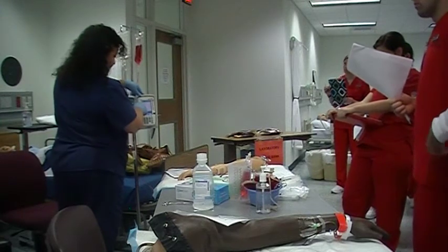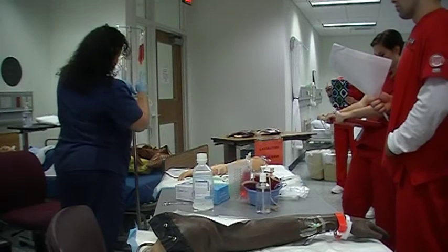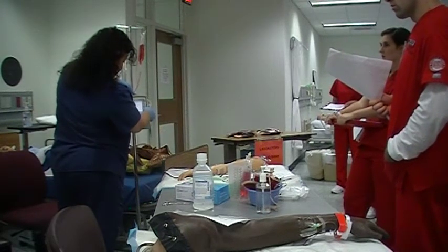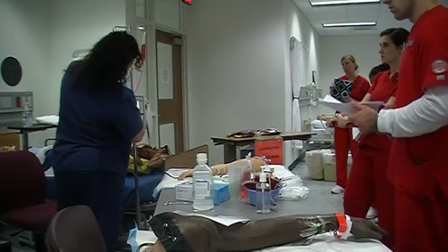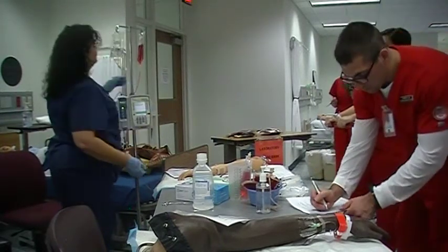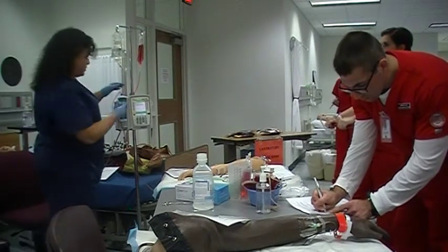Okay, channel select A is the only channel we have, so channel select A. Blood is considered a guardrails IV fluid. P for packed red blood cells. Okay, and it asks me, was red blood cells selected? Yes, and it gives a clinical advisory to never run anything with your blood, so you confirm that you see that screen.